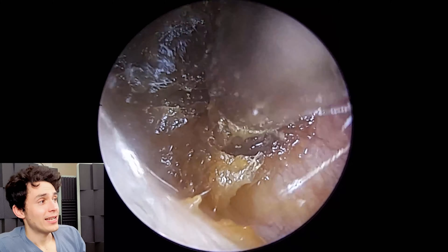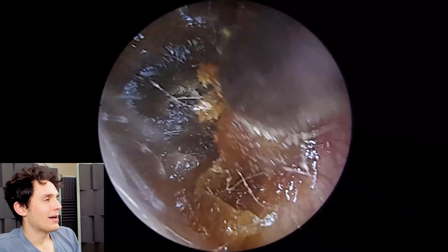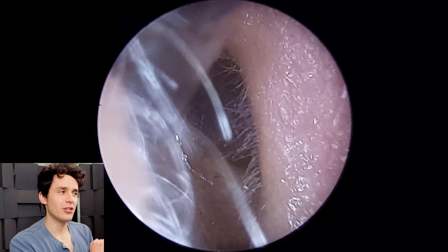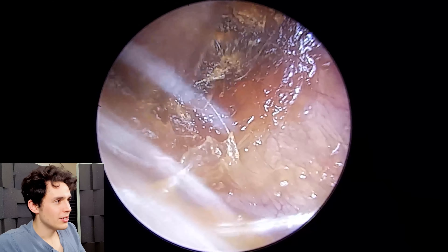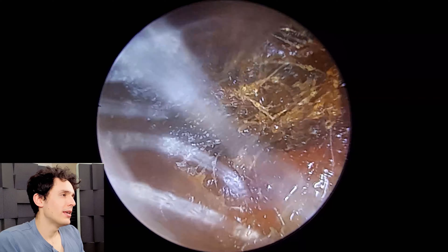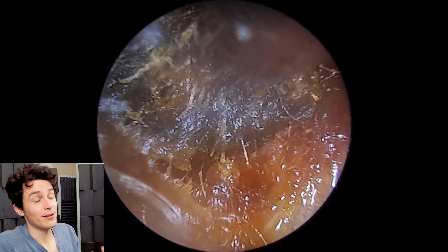Not only is the ear canal totally filled with this sort of dehydrated molasses-type wax, but there's also some adhered to the eardrum, which makes the procedure slightly more complicated — which is why I wanted to share it with you. At the moment we can see we're just stripping away bits and pieces. When you see me exiting in and out of the ear canal, it's because off camera I'm furiously dipping the suction probe in and out of water to try and unblock it and draw that wax through.